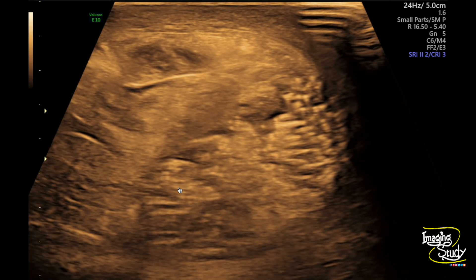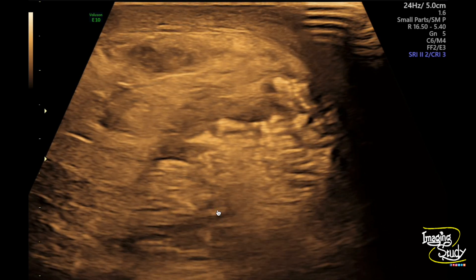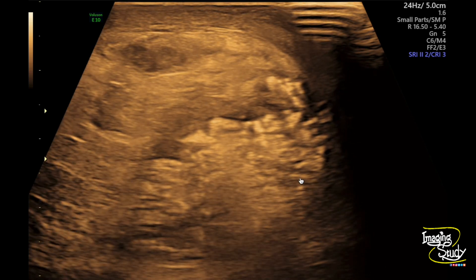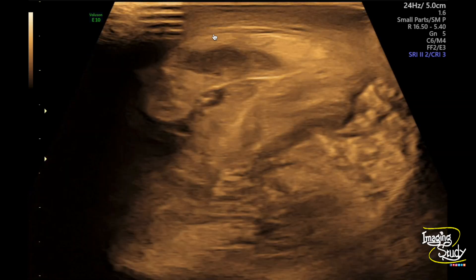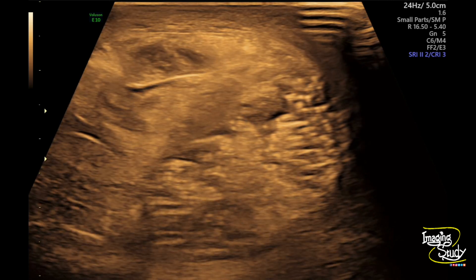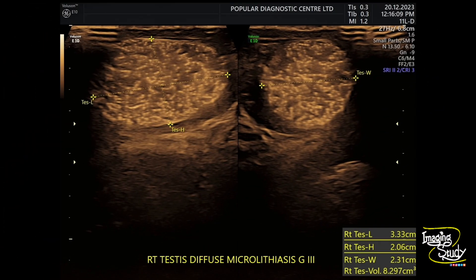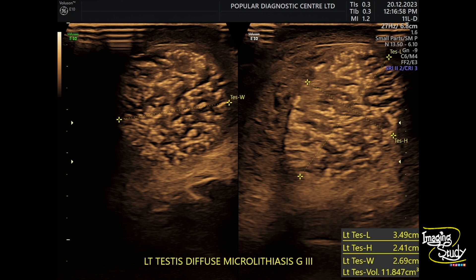Here's the last video. You can see the left testis with diffuse microlithiasis and tiny cystic spaces — these spaces are areas of necrosis. The epididymis is swollen and the skin is thickened. The right testis is apparently normal in size for this age with diffuse microlithiasis. The left testis is slightly enlarged; its parenchyma is relatively darker with tiny cystic spaces indicating areas of necrosis.